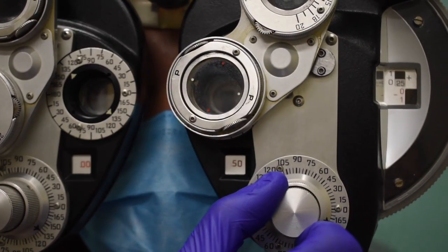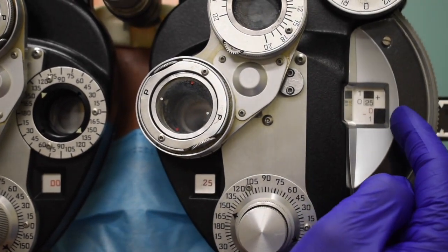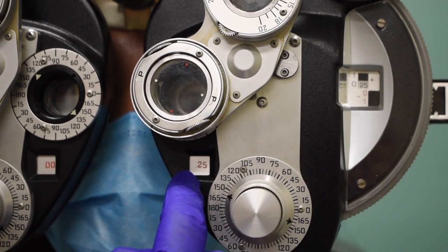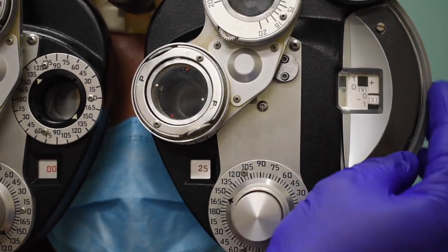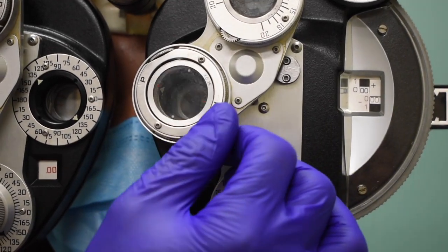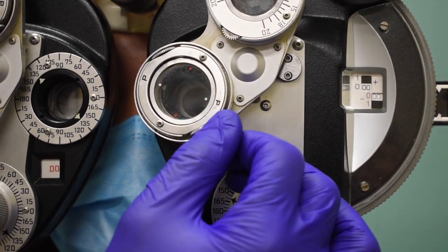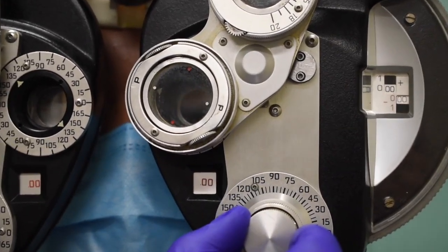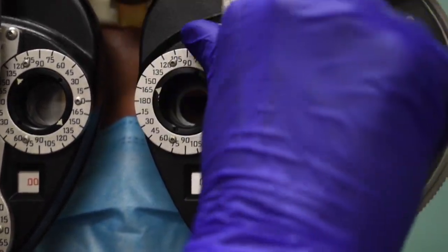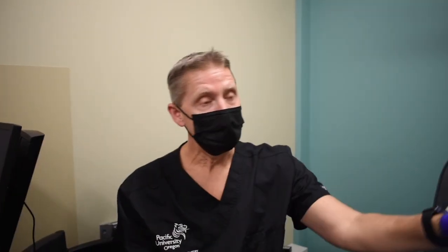Now she wants less power again so we take it out. Now remember we have to maintain equivalent sphere. We reduced it. Now we're at a quarter. Here we will drop it back to where we began. How about one here or two. Two. Great. And here Phoebe has kicked out all of the cylinder again. So she has no cylinder power in the left eye or the right eye. That is a properly performed JCC on each eye. That's the sequence up to this point. Next time we get together we will talk about our second subjective spherical refinement. How to balance a patient and we'll actually give them their prescription.